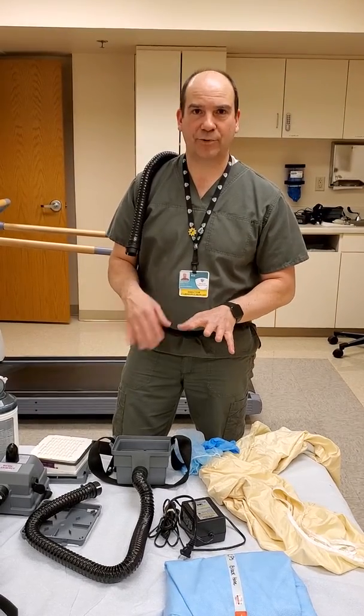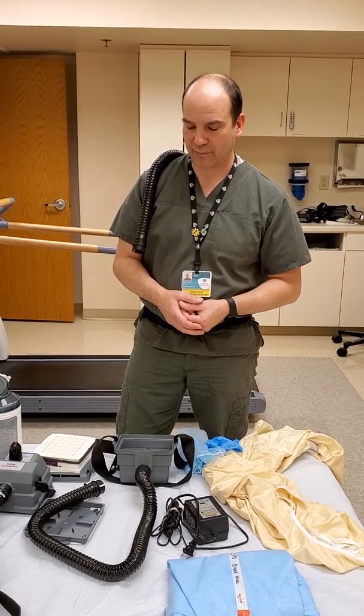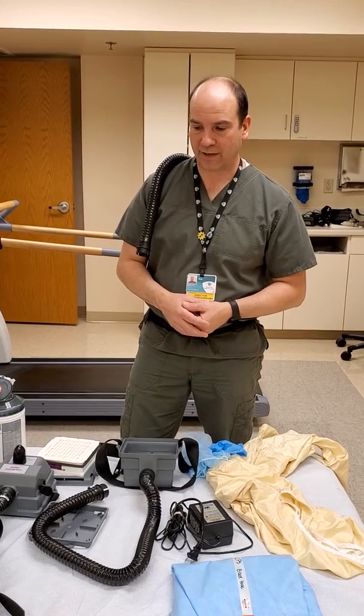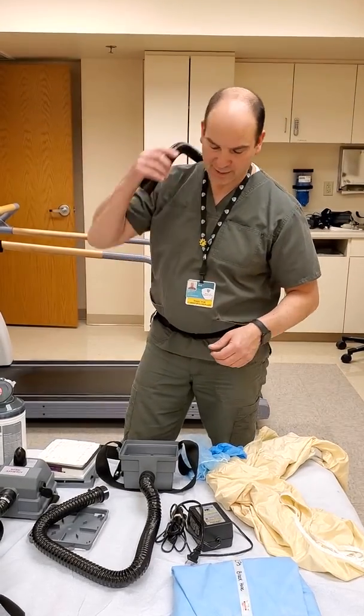We used to use these — we retired them last year and replaced them with some newer models. These are very effective at HEPA filtration and protecting you in an airborne isolation room.